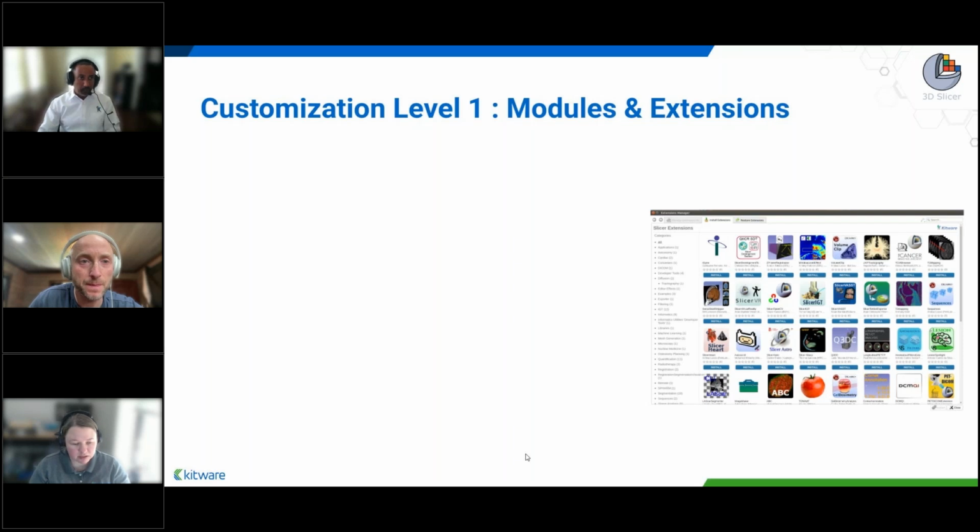Yes, I think we'll be looking at some of that in the looking forward section at the end, but it has been an overarching goal of the development team to transition 3D Slicer away from its current monolithic C++ code base to something that's more modular, more reusable as a library. Essentially, the goal is to pip install Slicer core and use that in your own application with your own UI. Currently, the application is monolithic, and it's very much tied into its GUI front end, which makes it harder to factor out pieces and reuse them.